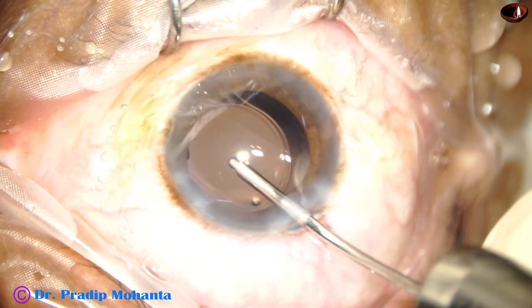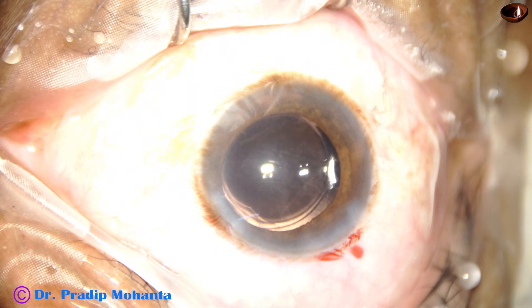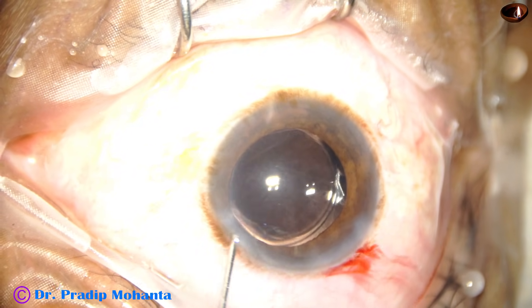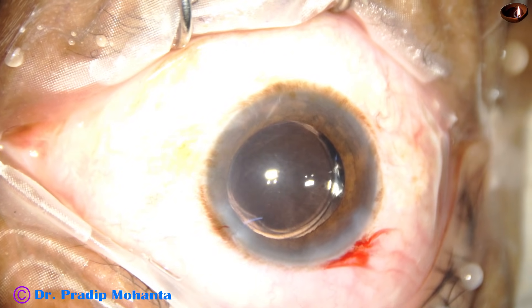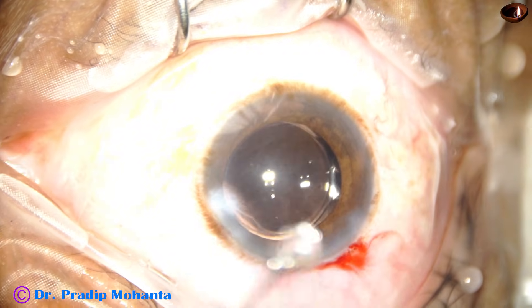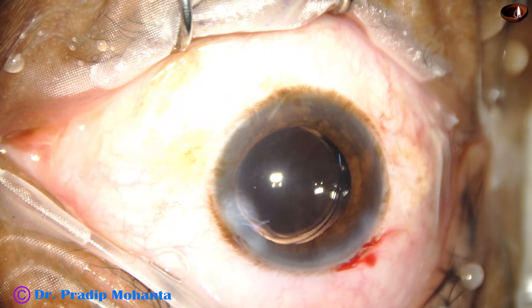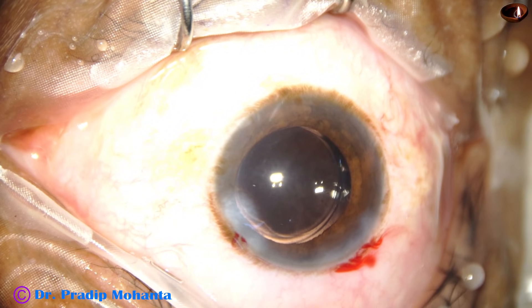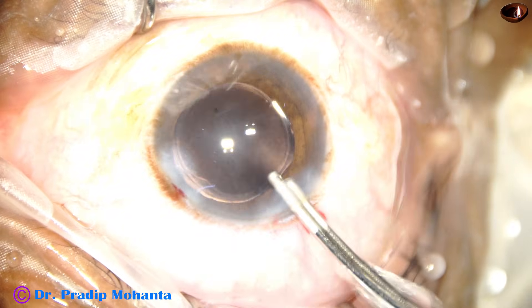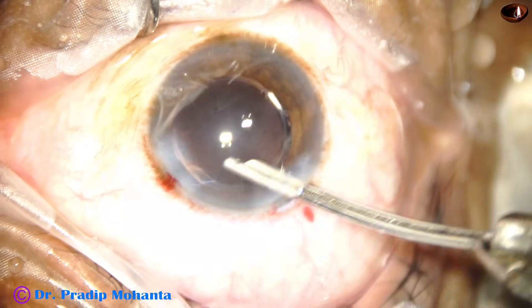Hydro implantation is very good for hydrophilic intraocular lenses, and even for hydrophobic intraocular lenses. But for multi-piece hydrophobic intraocular lenses, use viscoelastic substance and implant the lens. The side port is nicely closed. A final lavage is done, and any viscoelastic sticking to the corneal endothelium is gently removed.